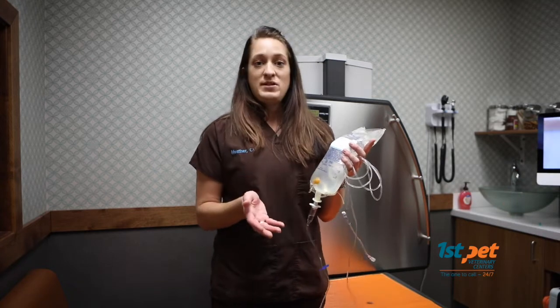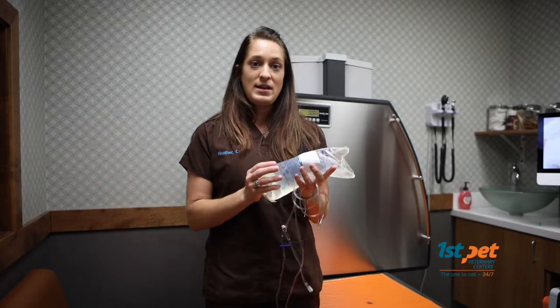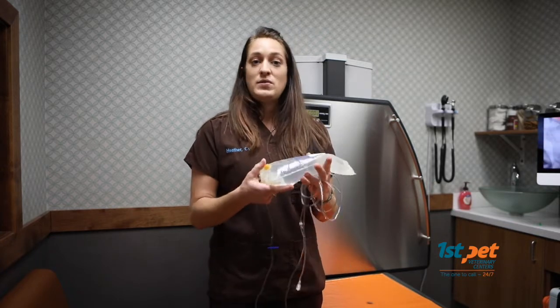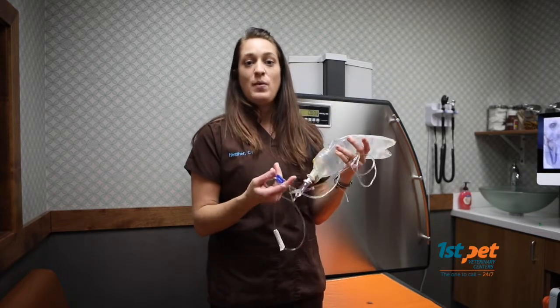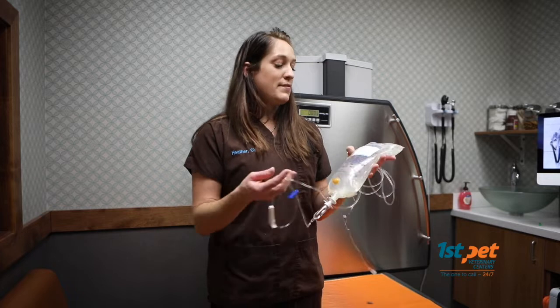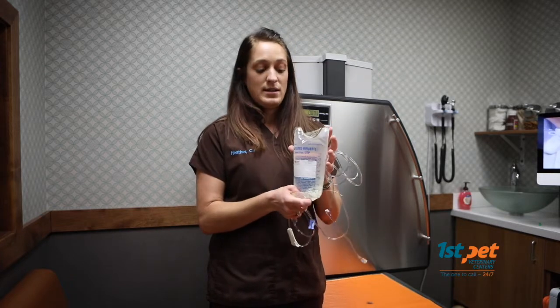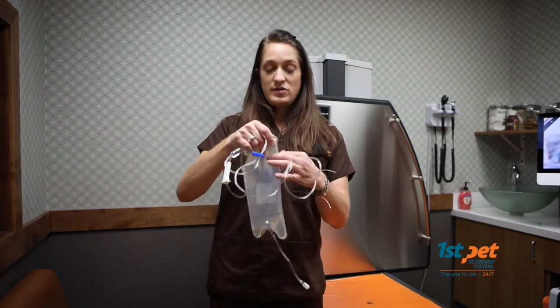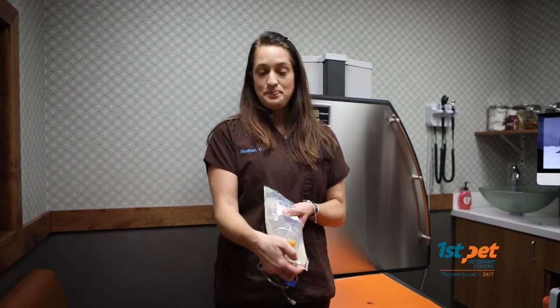If your patient's treatment is over and you no longer are needing any more sub-Q fluids, or if the bag is empty, it's time to dispose of it. If your bag is empty, you can simply dispose of the bag and the administration line in the garbage after you remove the needle. If there is still fluid in your bag and your pet no longer is needing sub-Q fluid therapy, you can use a scissors just to snip a little corner of the bag and empty the rest of it down the sink safely.